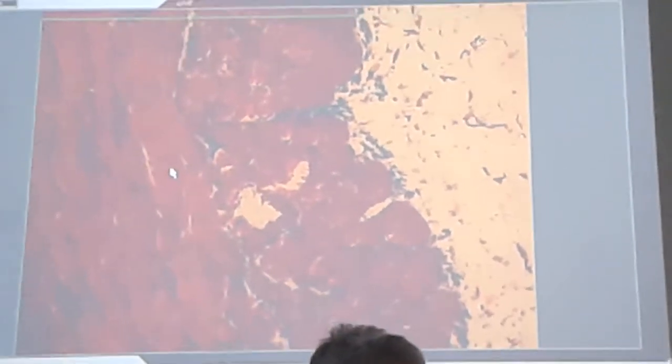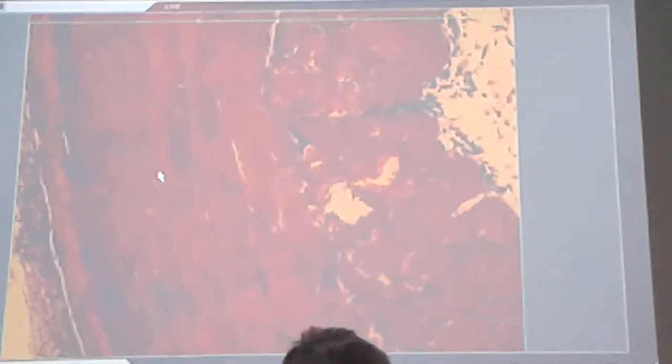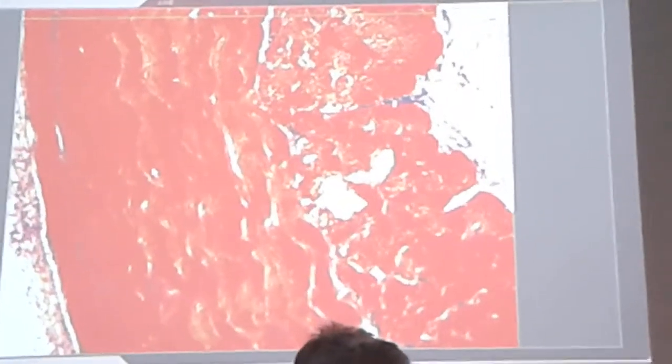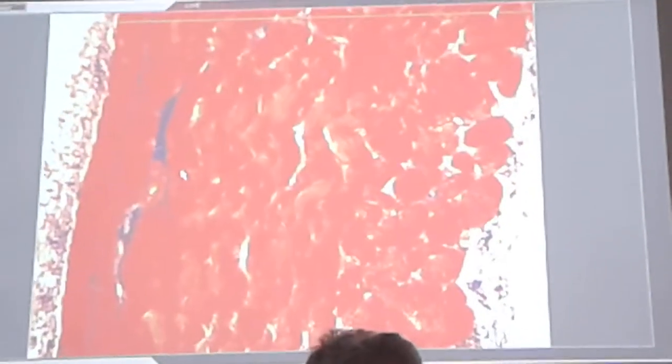So we may still observe some situations if I make some adjustments, but at the moment it is not very visible.